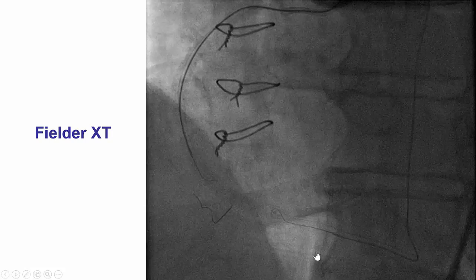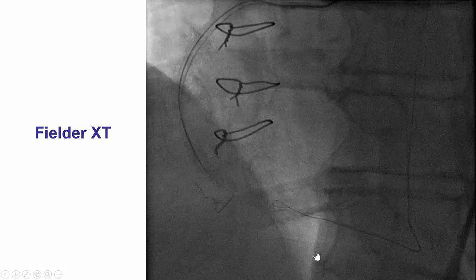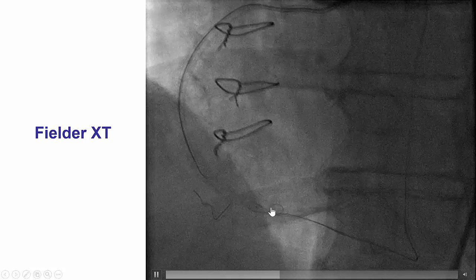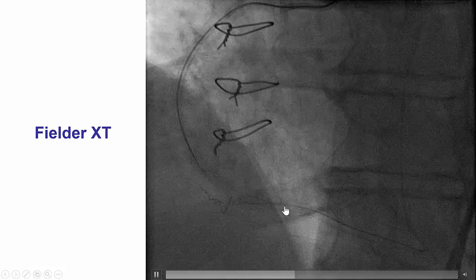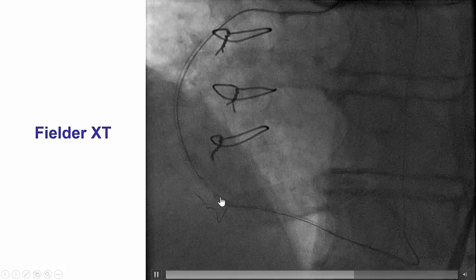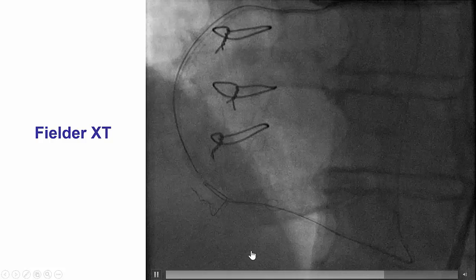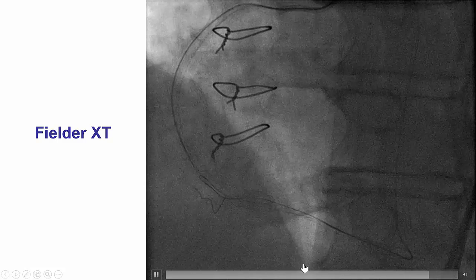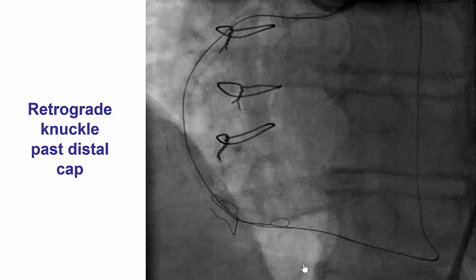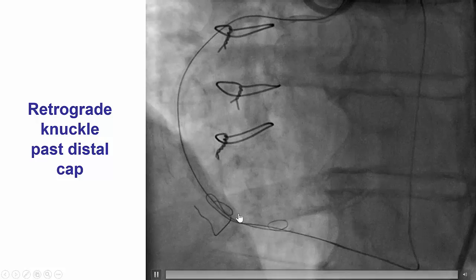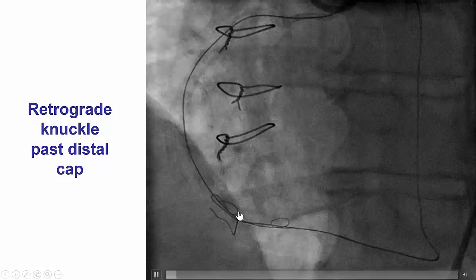With significant difficulty and after multiple attempts, we were able to advance a Fielder XT guidewire that eventually prolapsed into the subintimal space through the occlusion. We were then able to advance it further up towards the proximal cap and the proximal patent vessel, ultimately achieving a retrograde knuckle all the way into the proximal cap and proximal vessel.